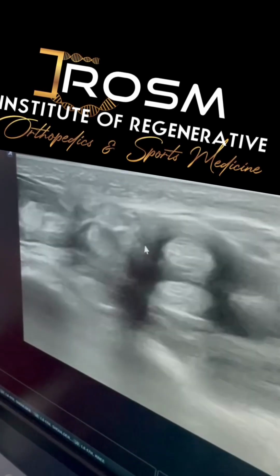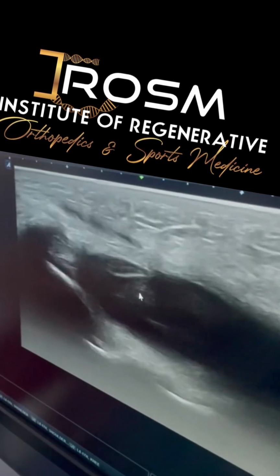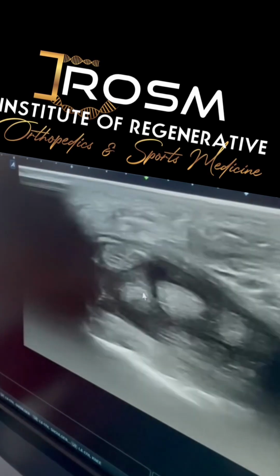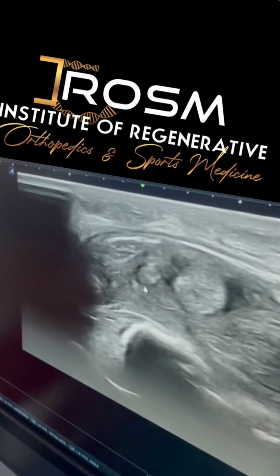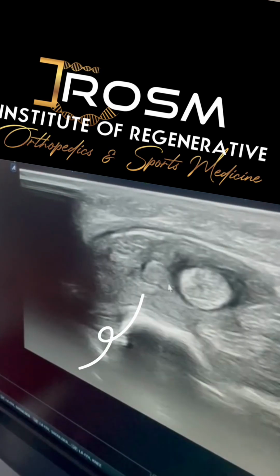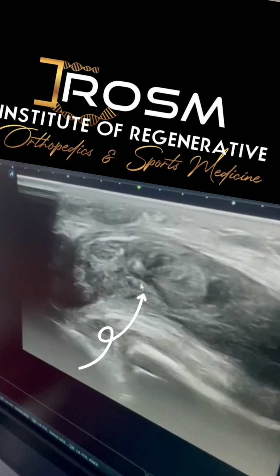And at this point, now I'm down here. You know, there's a lot of anisotropy at this point. But here, keep an eye on here. It's going to go away. I'm going back now. I just moved proximally. I'm going to find it again. And here, it went away.